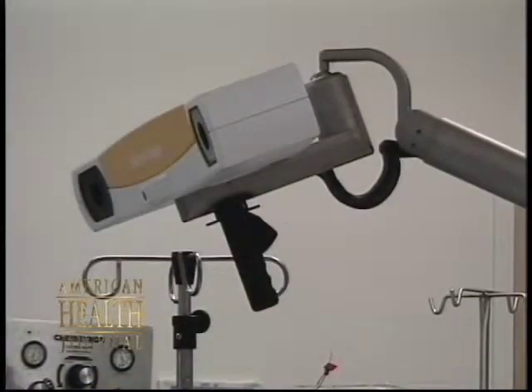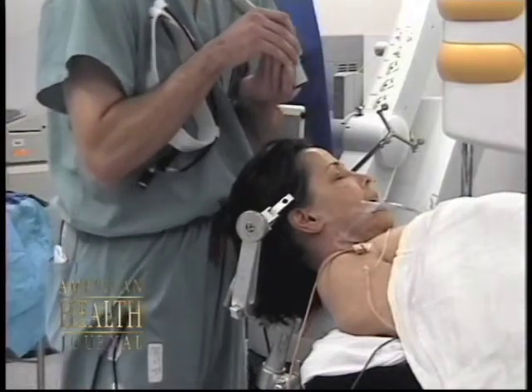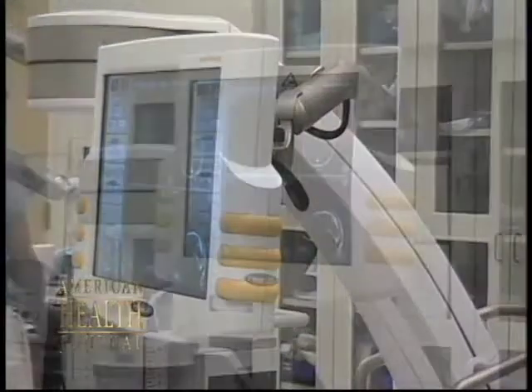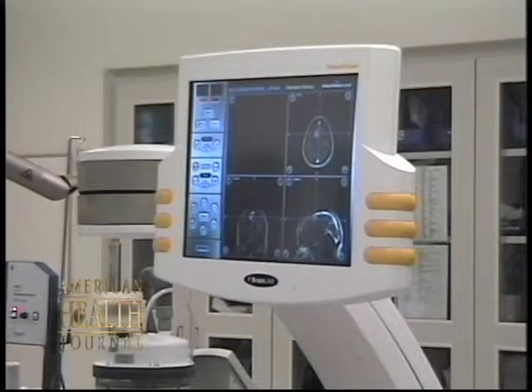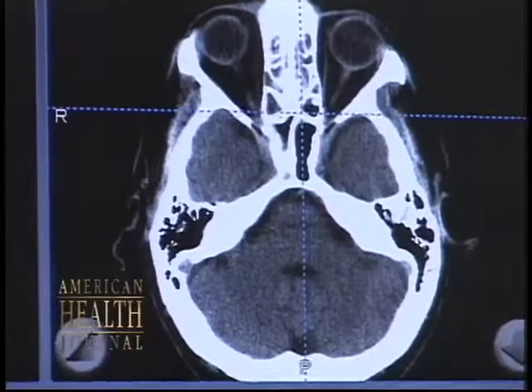So after the patient's completely prepped and draped and asleep, and we've scanned them into the software, you have a monitor that has a three-dimensional display of exactly what anatomy is being pointed to by your probe during surgery. As you make your incision, you simply take the probe and overlay skin or other structure that you want to identify, and it shows you in three dimensions what that structure is in relationship to the rest of the anatomy and makes it very easy to identify.